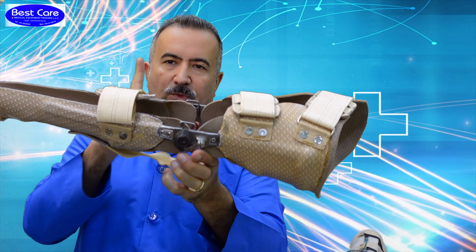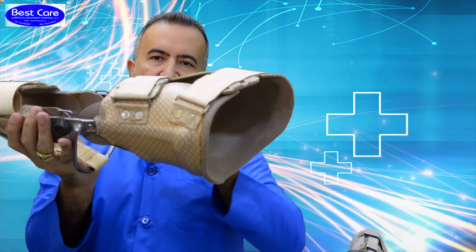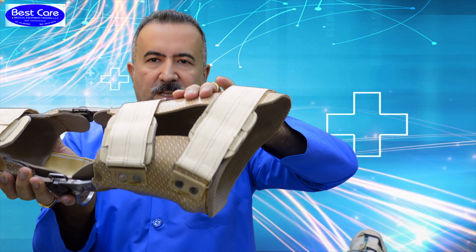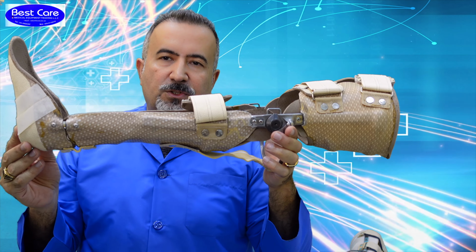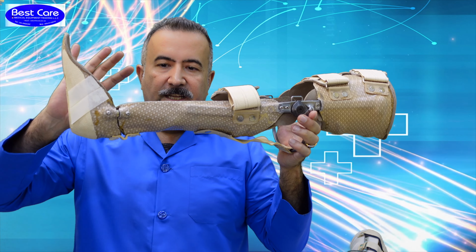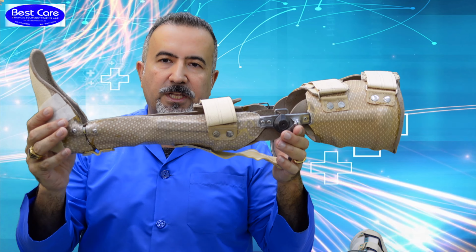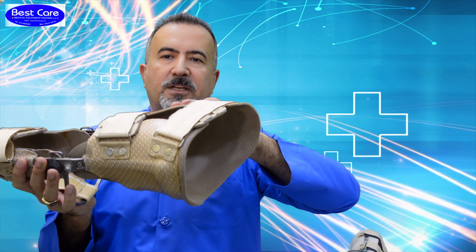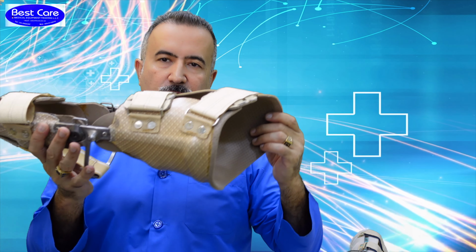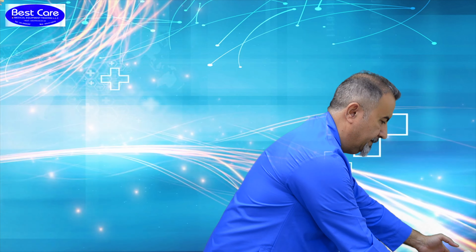All will be done in one-time lamination, but half of it is a solid lamination, another half is flexible lamination. And in this one we are able to decide where we want it to be stronger, how many layers of carbon we are putting, and above how many layers also, but flexible to be easier for entering the orthotic and to use it.